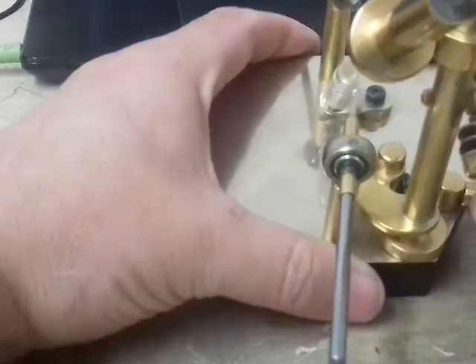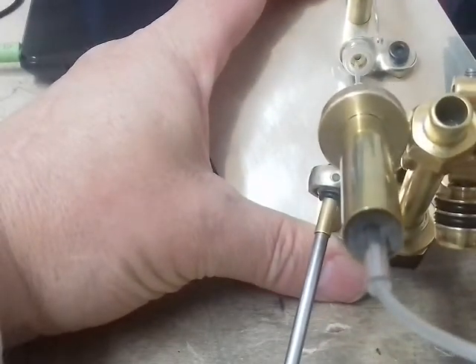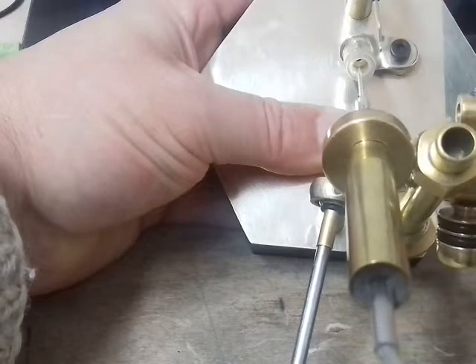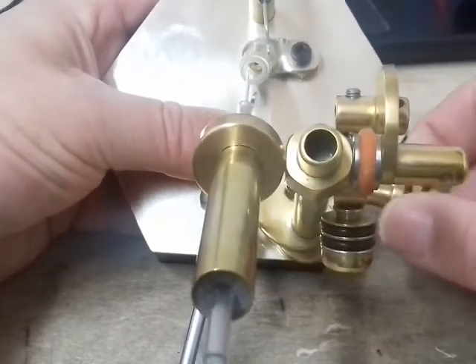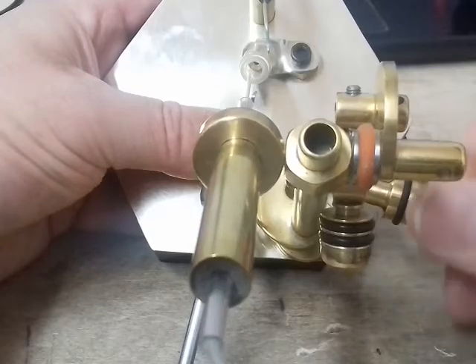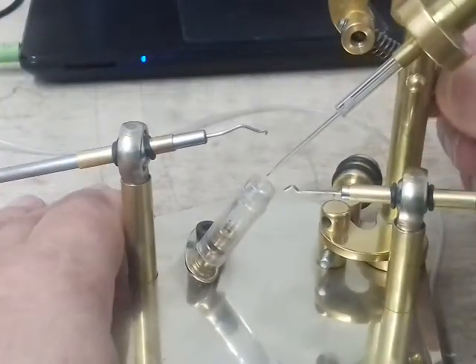If I actually tilt it that way, you might be able to see the needle moving. There we go. Hard to keep it still. Got a lot of control over that, a lot. You see the whole unit moving itself rather than the needle itself, and then from the side you can see the vertical movement.